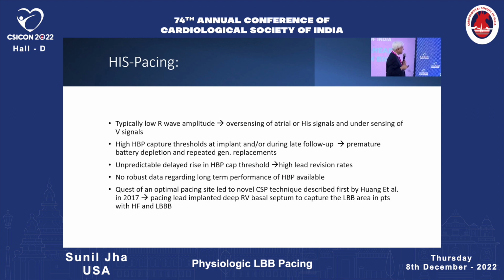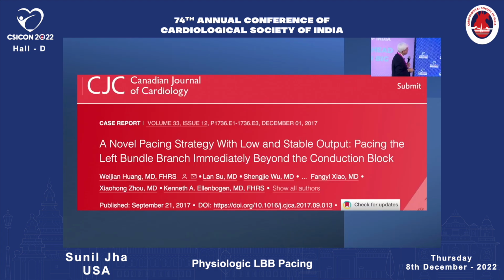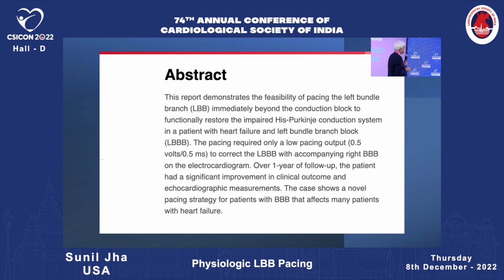So the question of an optimal pacing site led to a novel cardiac conduction system pacing technique described first by Huang et al. in 2017, and the pacing lead was implanted deep into the right ventricular basal septum to capture the left bundle area in patients with heart failure and left bundle branch block. And this was basically a case report from Huang.